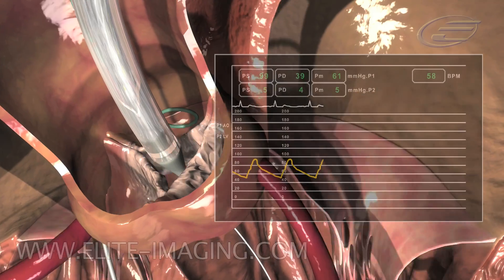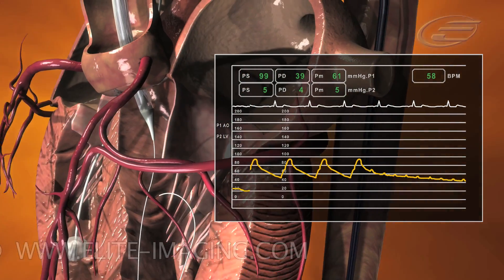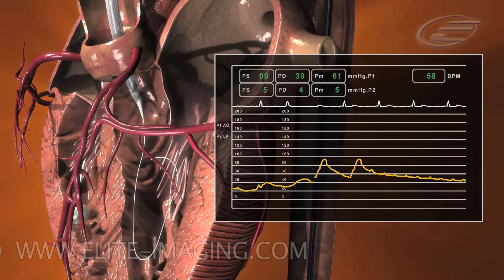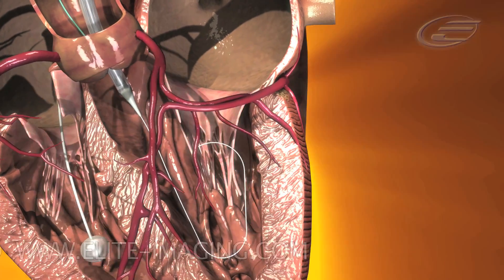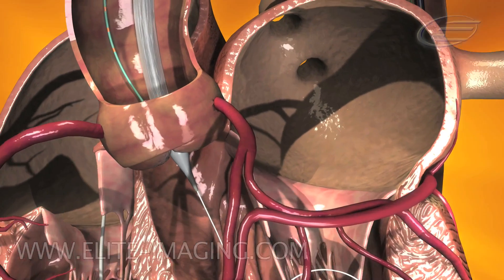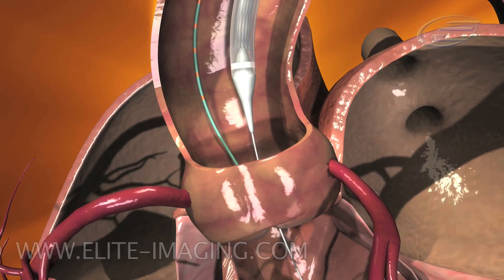Advance the catheter through the native valve. Note: during initial crossing of the valve, it is possible to have an unacceptable drop in systolic pressure. If systolic blood pressure drops below an acceptable level, withdraw the catheter into the ascending aorta and ask the anesthesiologist to increase blood pressure.